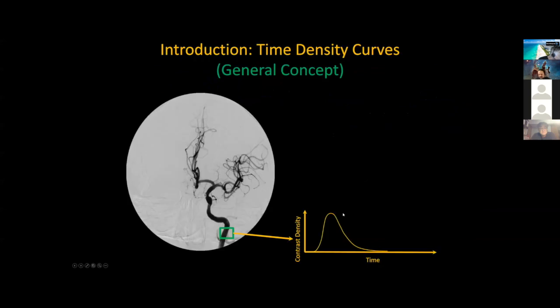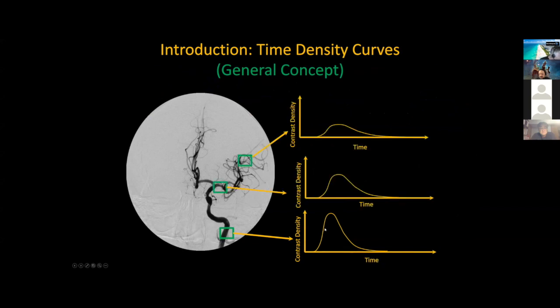So how we do that, I told you before, I'm just going to go really briefly. We look at things like dye dilution curves, and as the contrast propagates through the system, they tend to spread, and this is exaggerated. The differences are slighter. But we can look at these parameters and infer, kind of estimate, what hemodynamics are going on in there.